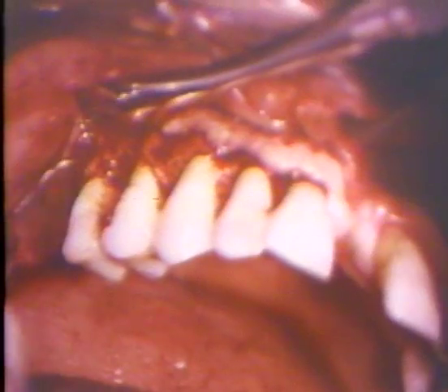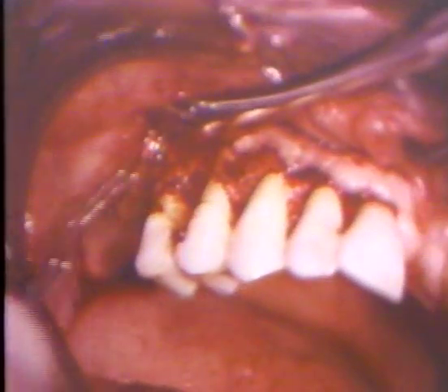It is used to remove any loose pieces of bone and any remaining soft tissue fragments. Care is taken to try and create a positive osseous architecture. This term implies the interdental septum extends more occlusally than the adjacent buccal bone. This is the shape prior to development of the defect.